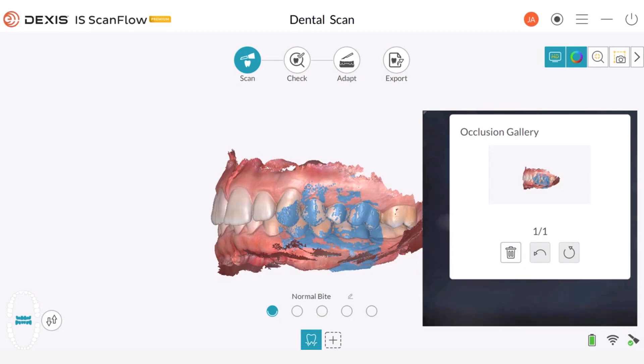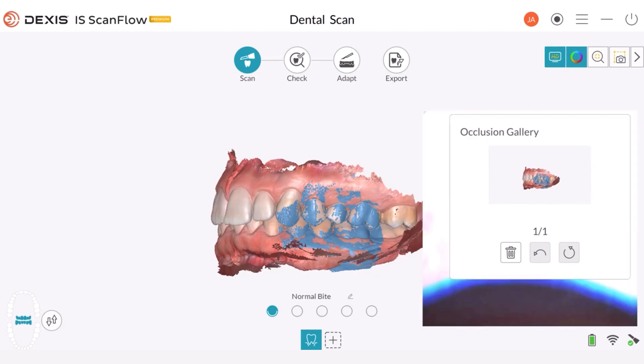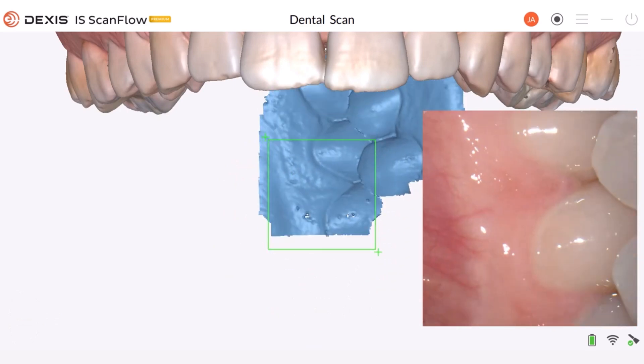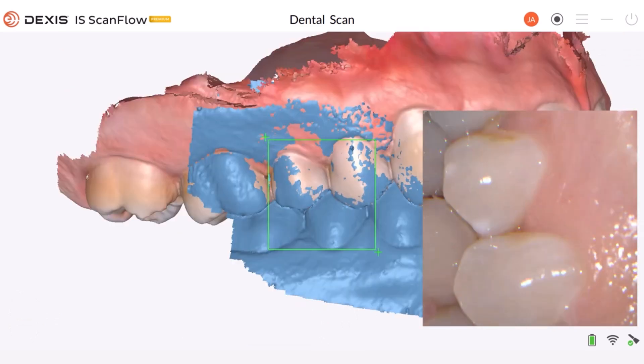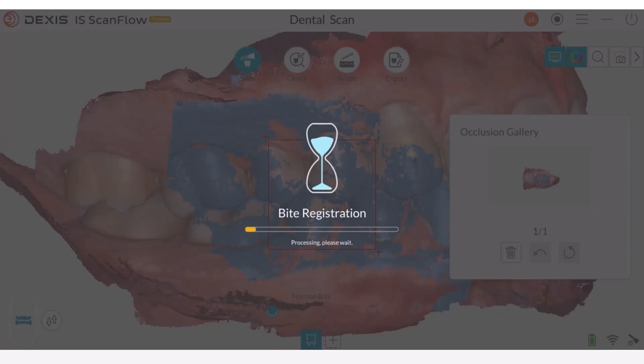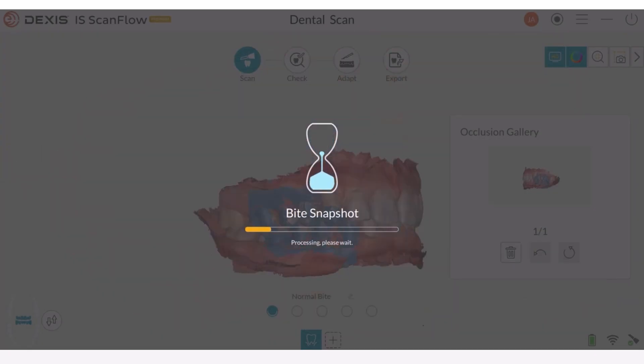To make sure that the bite is accurate, we can take another capture from another area. Again, without using the computer, I'm going to follow the same process. Once again, the scanner captured the bite very quickly. If the scanner encounters difficulties capturing the bite registration immediately, you can make a gentle sweeping motion to assist the process.